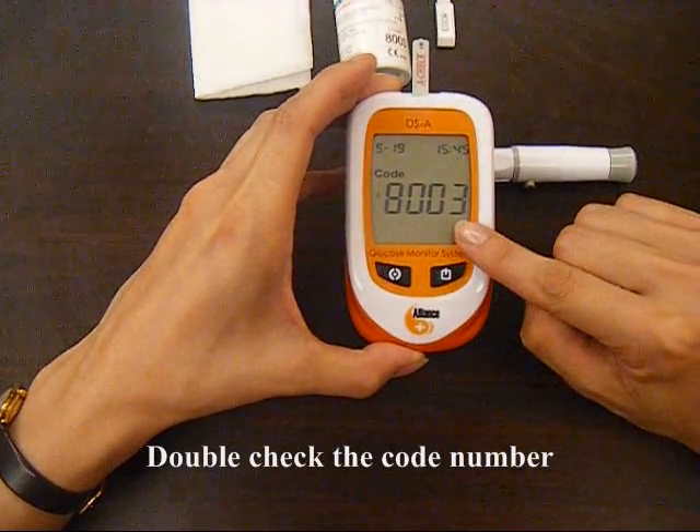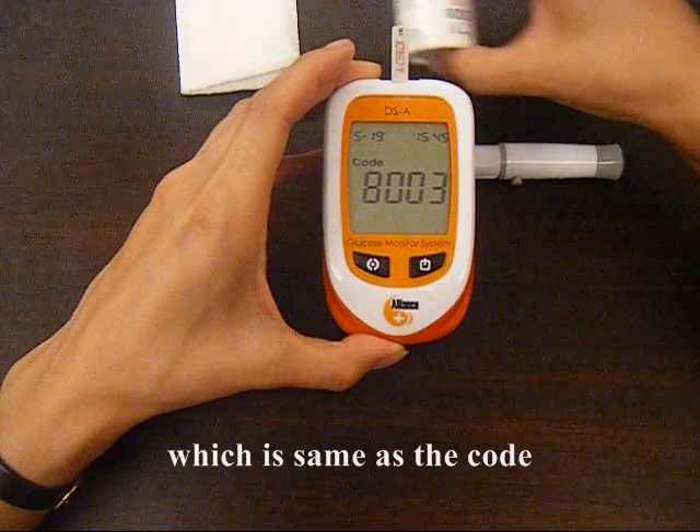Double check the code number shown on the meter, which is the same as the code on the test strip vial.